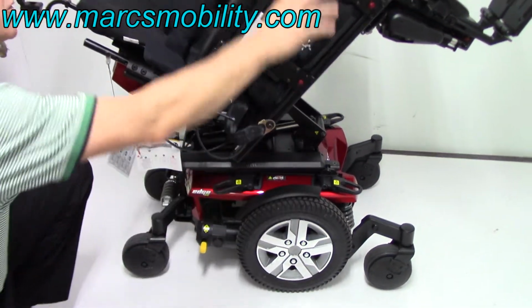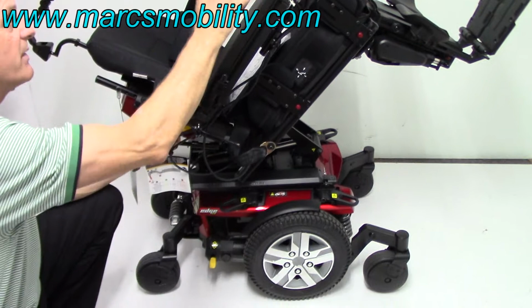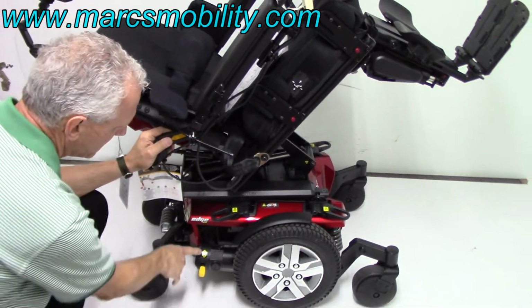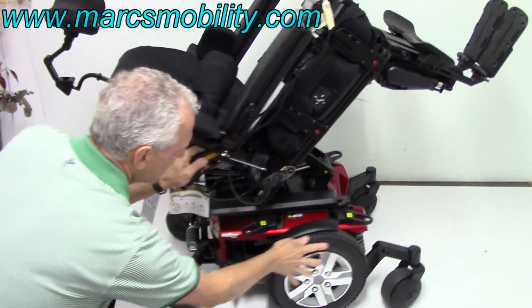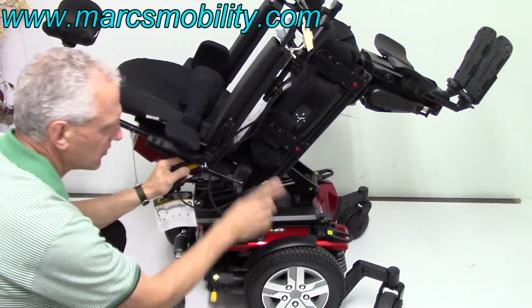If you need to put this chair in neutral, you would turn the power off. Always make sure your power is off. There's a lever that tells you here to go to neutral, you push it down. When you push it down, you can see the wheel is unlocked. You have to do both sides.